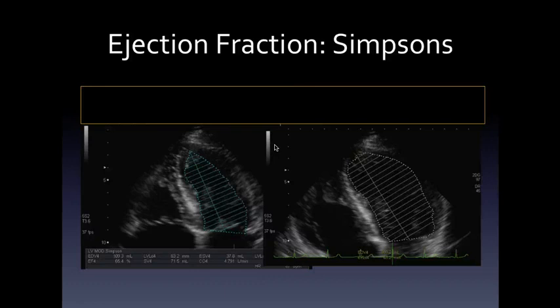So using this methodology, you get a normal left ventricular ejection fraction if the patient has an acute posterior infarct, because you don't get that wall in this view. And that's a significant weakness. So as I said, it's really not perfect. It's sometimes hard to get a good apical 4 chamber and an apical 2 chamber view. And certainly that's the view, for me personally, I find the hardest to get actually. I find a good apical 4 chamber can be my hardest one to get.